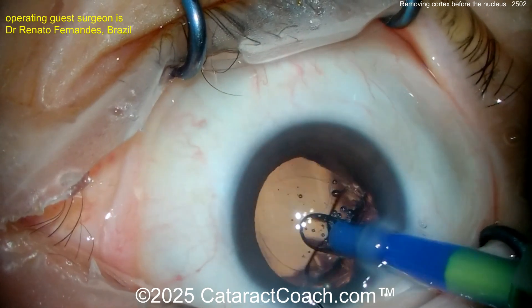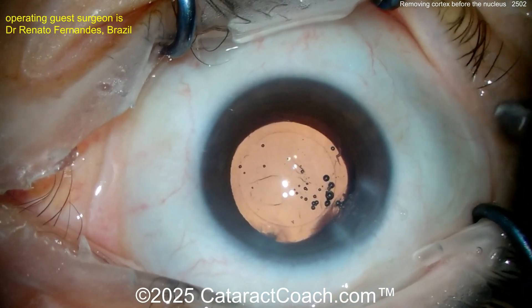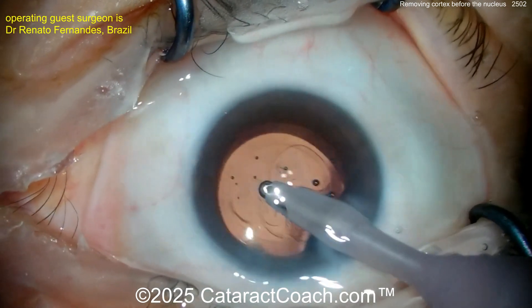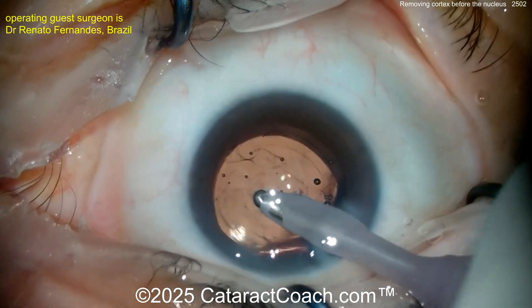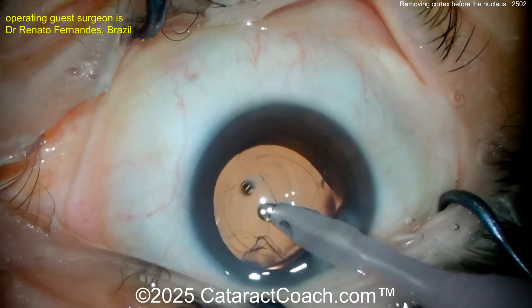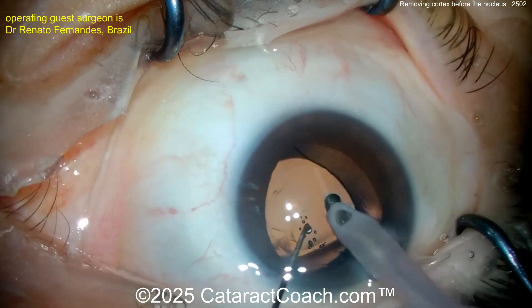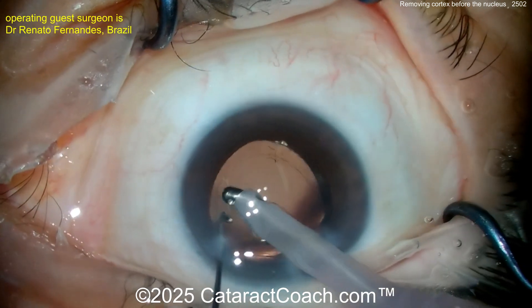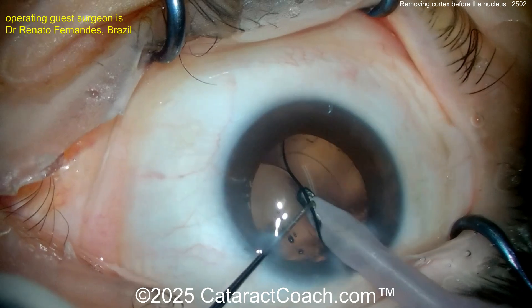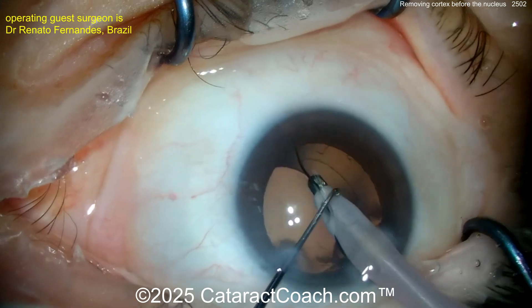This is a big hydrophobic acrylic lens with four haptics — it's going to be a lot tougher to rotate. But it goes in the eye. Look at that beautiful rhexis. Now let's take out the viscoelastic. I aimed the probe port toward that area where that residual cortex was, just to make sure we get it out. There's that last little bit of cortex — residual cortex will cause some inflammation postoperatively, but it tends to resolve fairly easily. Going behind the optic to remove the viscoelastic — that's a good maneuver.